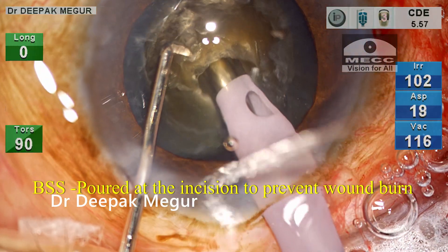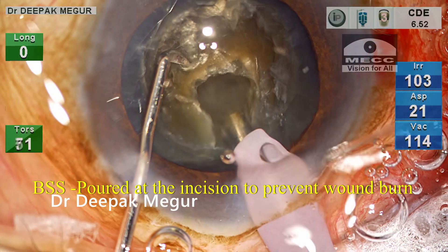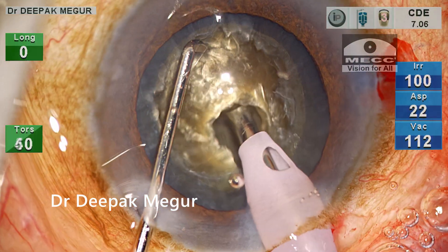Please note that my assistant is constantly pouring cold BSS over the incision site to minimize the chance of wound burns.